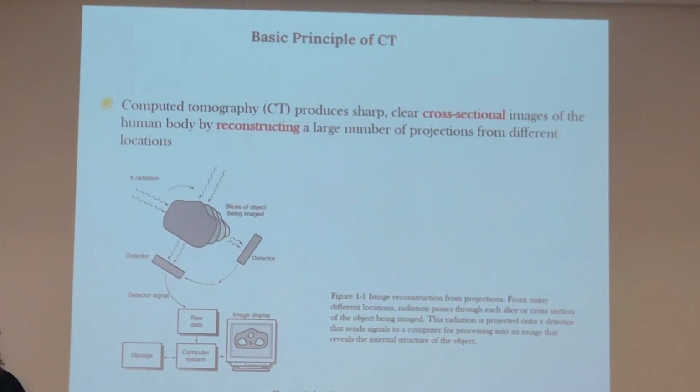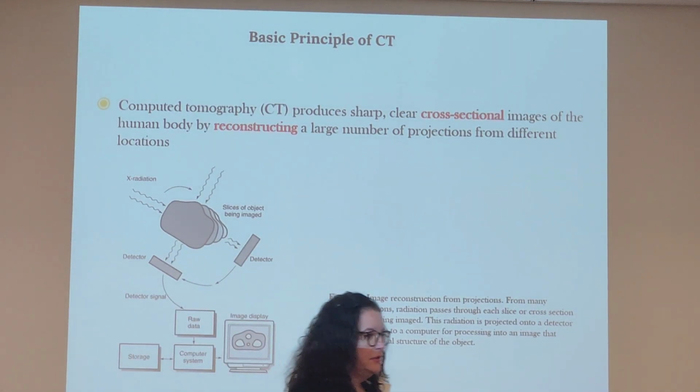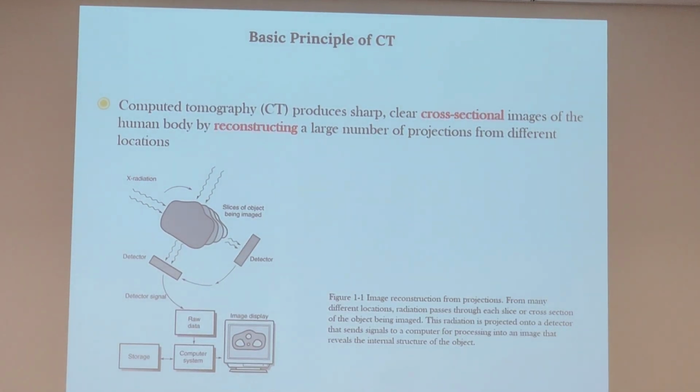So there's a 3-step process in acquiring a CT image. And so remember, it's all about the display. So if I'm using the technology of CT, it's about what I want to see as a display. If I wanted X-ray, I'd send them to X-ray. If I wanted an MRI, I'd send them to MRI. But if I'm specifically going to send them to a CT, I want a CT image, and I want the software capabilities or the mathematical algorithms that are sold in software packages to maybe enhance those images, to better isolate any type of foreign body, pathology, anything of why they're there, correct?